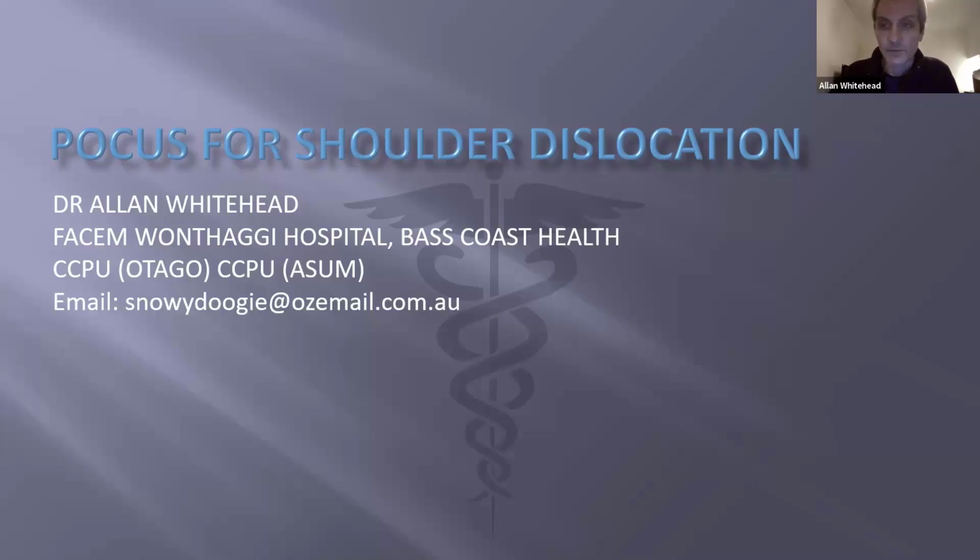So I'm going to take you through a few cases. I think I've done about 30, with ultrasound pictures, but I'm not going to show you all 30 cases. I think I've got about eight or nine cases, which I'll just show you representative images. And then I'm going to take you through a couple of other similar pathologies that you can basically use the same principles for. And then we'll talk about options for pain relief prior to the attempted relocation. And so hopefully you'll learn one or two new things.